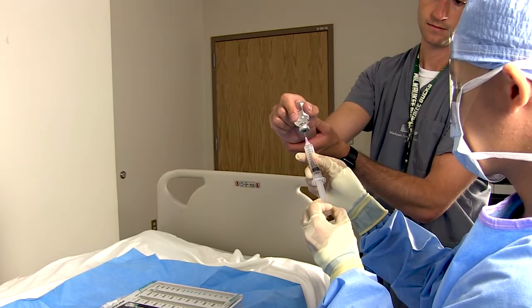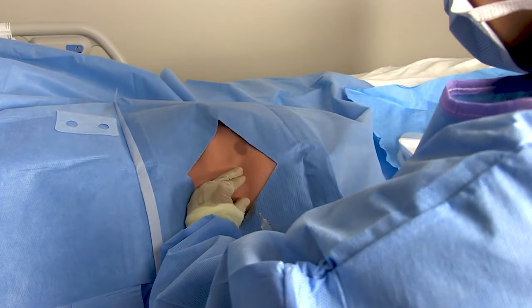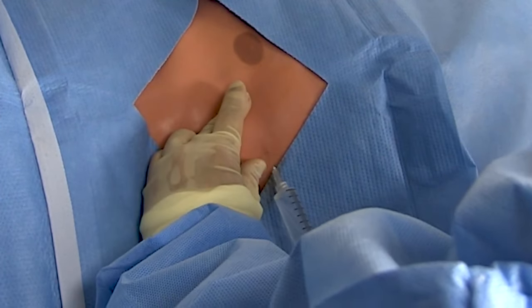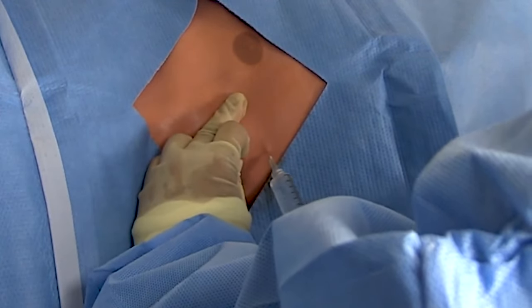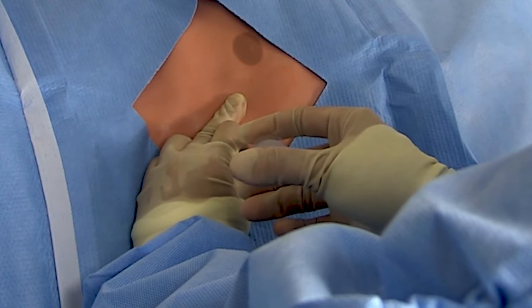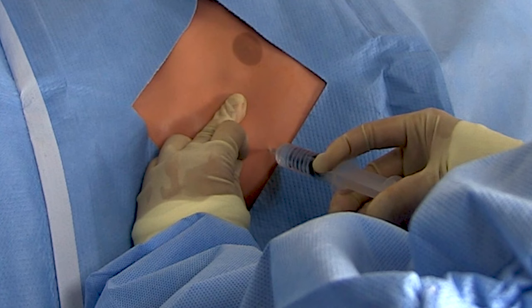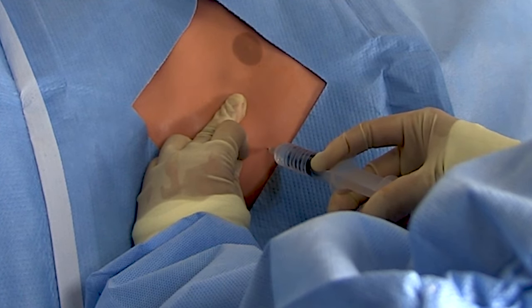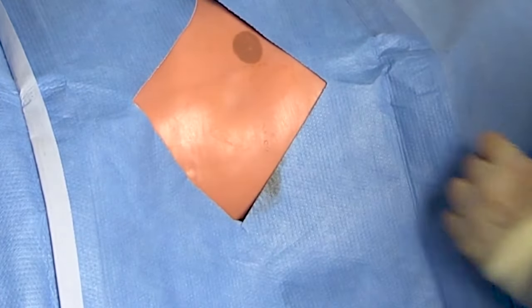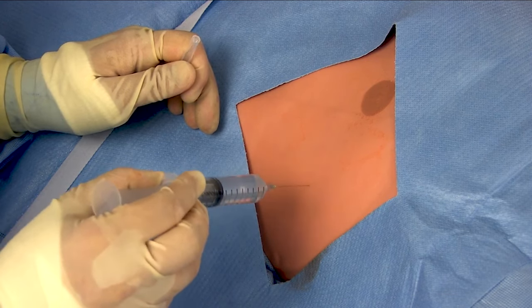Alright, with the prep out of the way, let's get to the good stuff. Draw up some local and get to injecting — these are very painful procedures, so make sure the patient has adequate anesthesia. My technique is to first make a little skin wheel with the local, then drive the needle down until I hit the rib. Once I've hit the rib, I inject the periosteum right there. Then I maneuver the needle over the rib and go a little deeper until I've hit the pleura and inject liberally there. Finally, I slowly withdraw the needle and inject on my way out to get the entire tract. Wait about five minutes, then do a little skin test with a sharp instrument to make sure the patient can't feel.